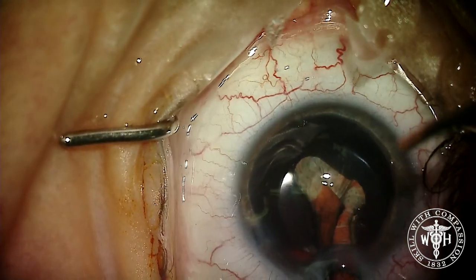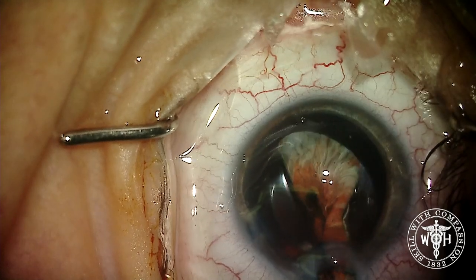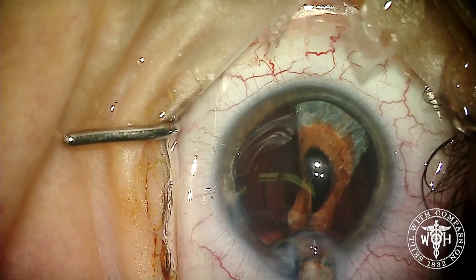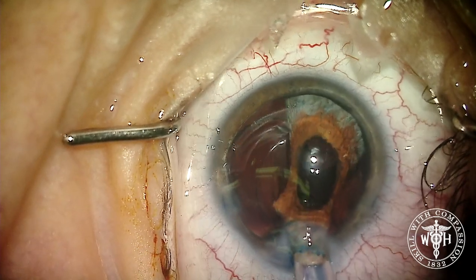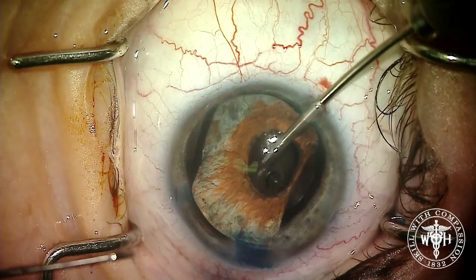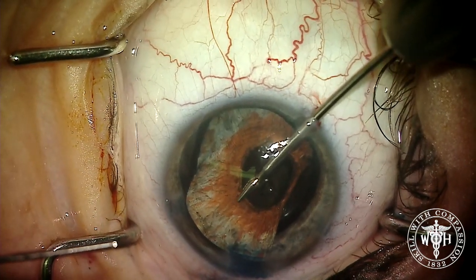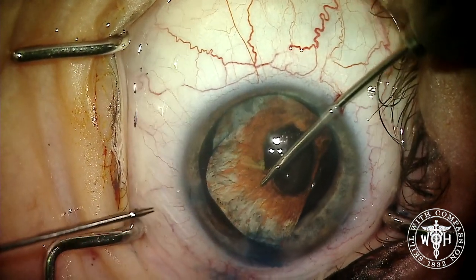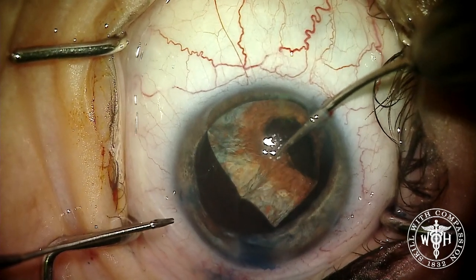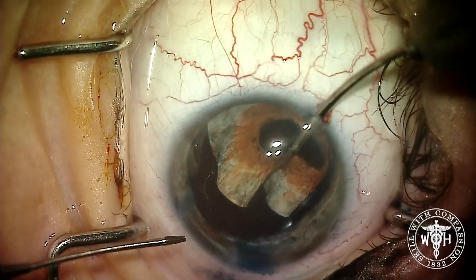You want this to open up colored side up, not black side up. You can see that Vision Blue-stained capsule really helps see that iris going into the capsular bag. We use a combination of micro forceps — usually two of them — to help tuck and pull this artificial iris to slowly dunk it into the capsular bag.